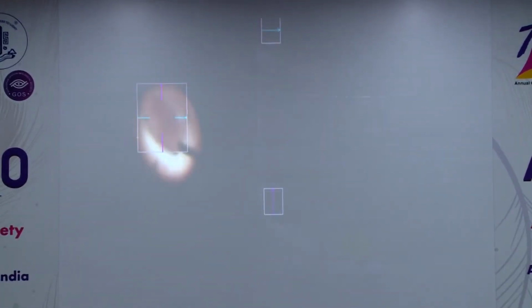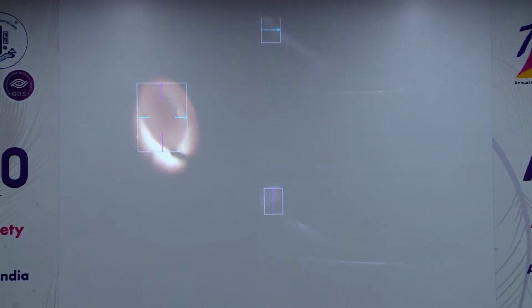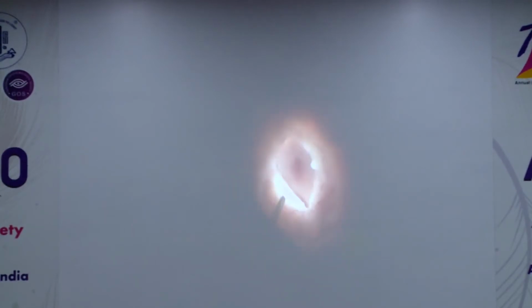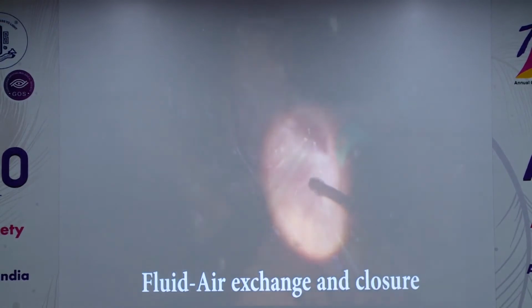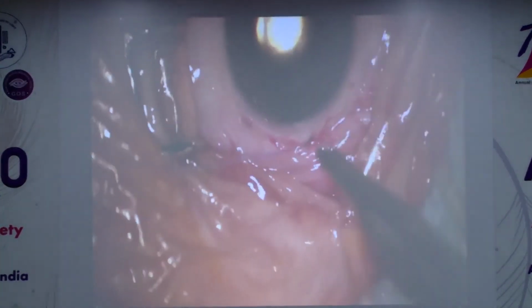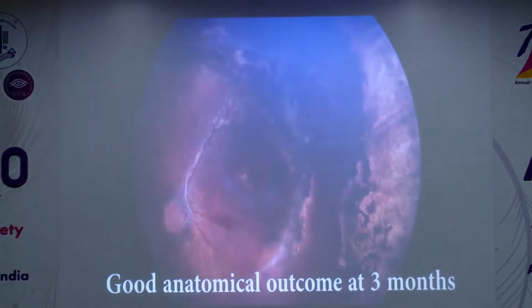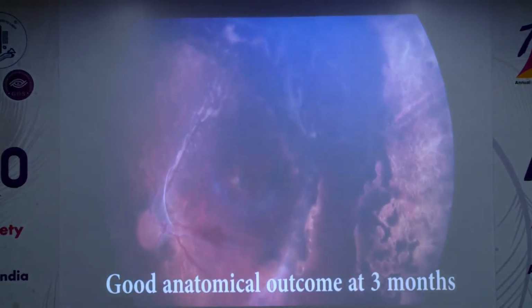An OCT after the release of the traction demonstrates a substantial reattachment of the temporal retina. The case is closed after a partial fluid air exchange and suturing the sclerotomy ports. The patient had a good anatomical outcome at 3 months after the procedure.